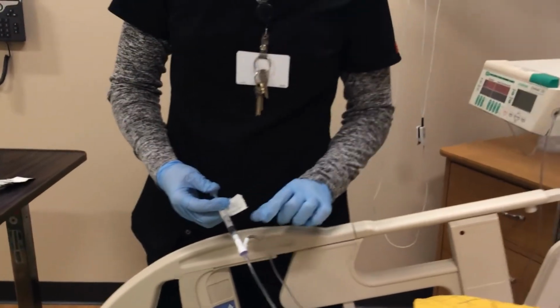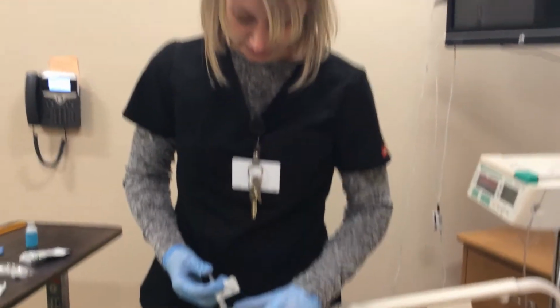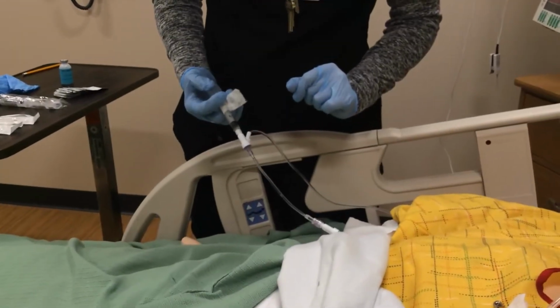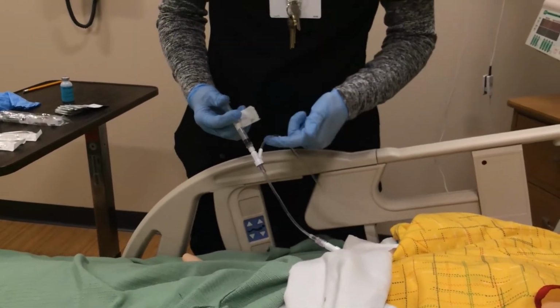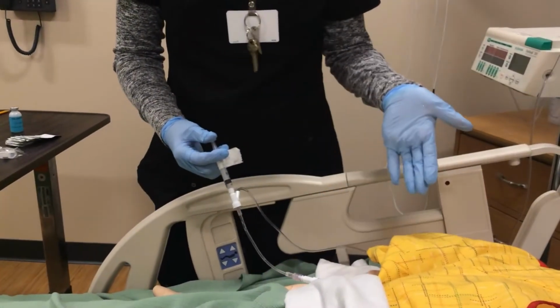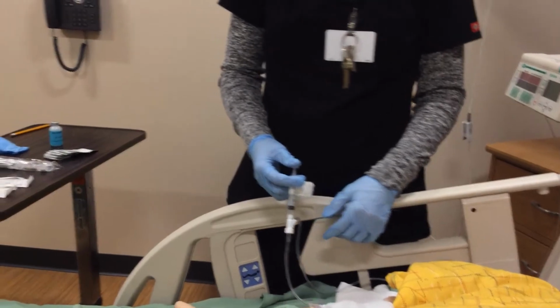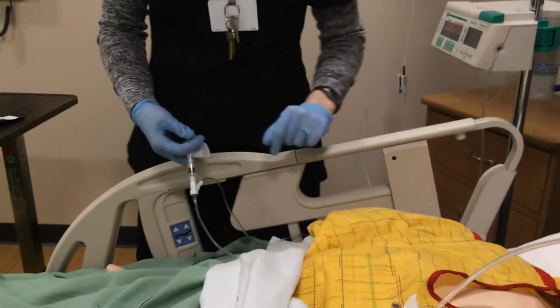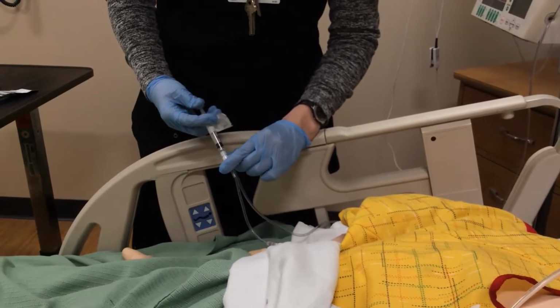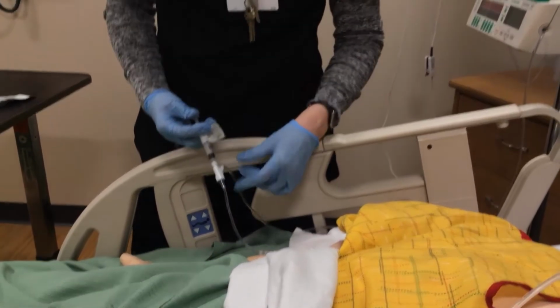So what I did was I hooked it up there, twisted it on, I pushed back here, and I just gave a little push to that medication, okay? And then I'm going to release, and what's happening is this IV fluid is actually just going to carry it right in, okay? So I'm watching my clock on the wall. I do have a watch on my wrist, but I love that clock on the wall. It's just as nice and big and right there. So then, after a little bit of time, I'm going to give another little push, and then release again.